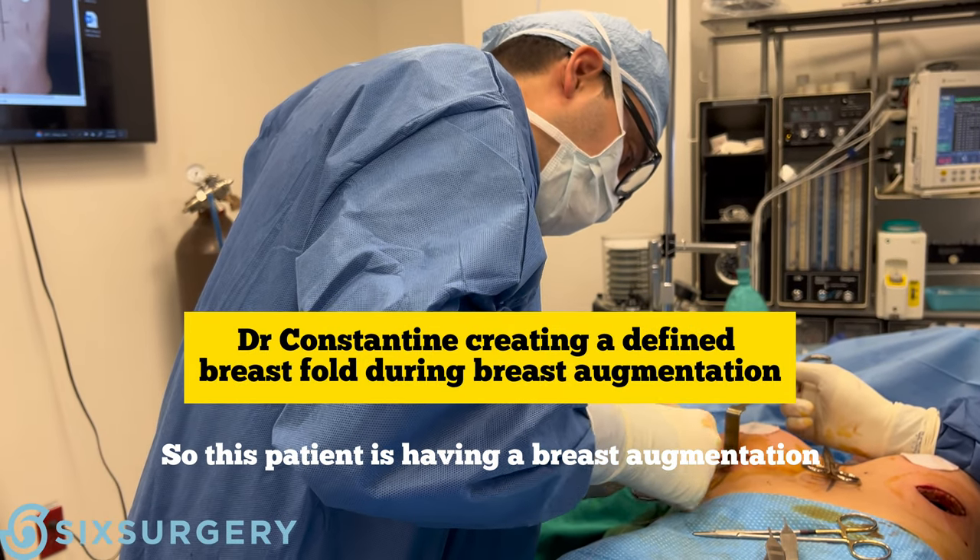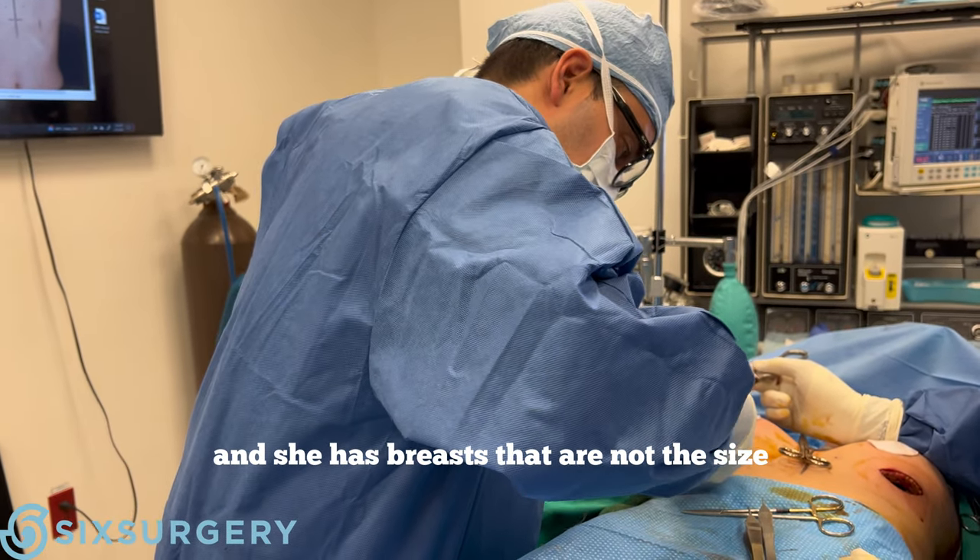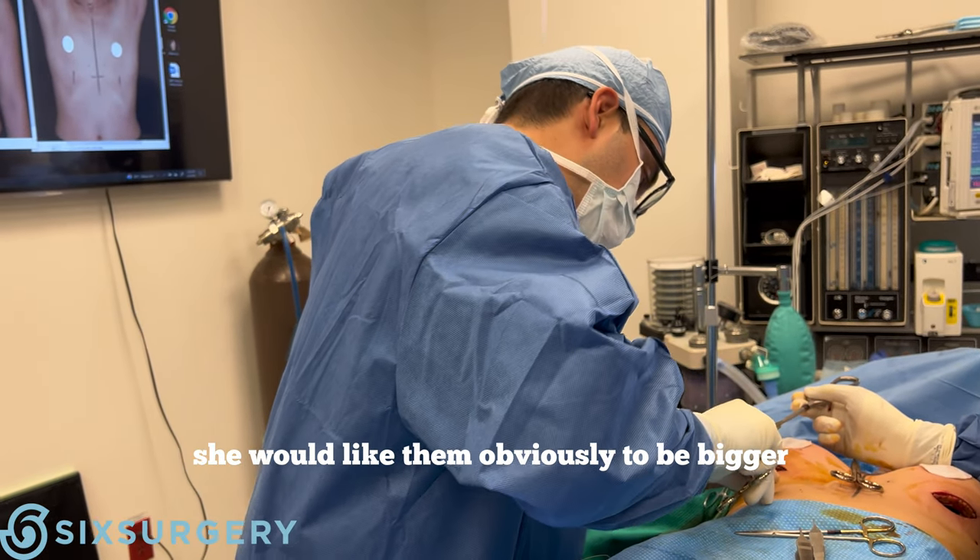This patient is having a breast augmentation. She has breasts that are not the size that she would like them to be — she would like them to be bigger.